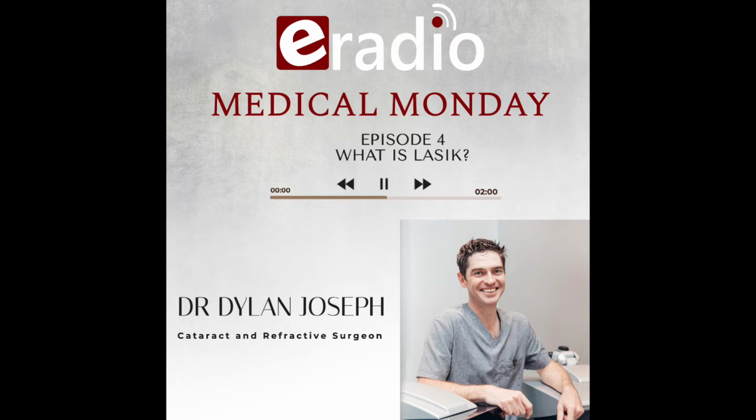So Dr. Joseph, how do you do this? I mean, how does the whole process work? I've seen you standing at a machine and then you look into this little lens or something. Is that the actual laser machine or not? So there's two microscopes that we actually look down, Ian. With regards to our current technology that we use in the practice, we use two lasers that do the LASIK procedure. So LASIK is actually made up of two parts, two components.